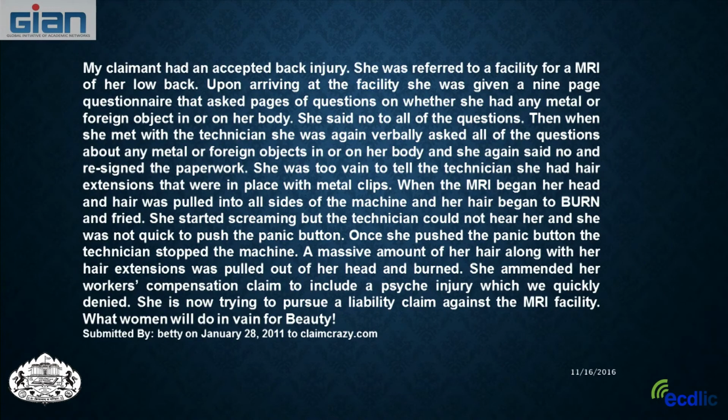Okay, this is an interesting story here. So a lady went into the MRI center to have a scan. She was given a 9-page questionnaire that asked all about metal or foreign objects in her body. She said no to all these questions. She met with the technician, who again went through this, again verbally asked her, and she said no to everything.